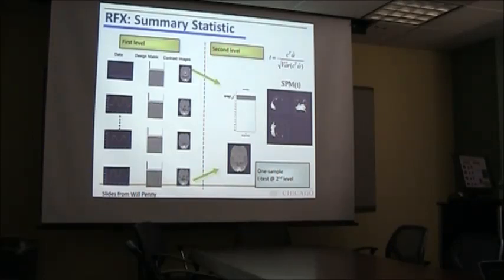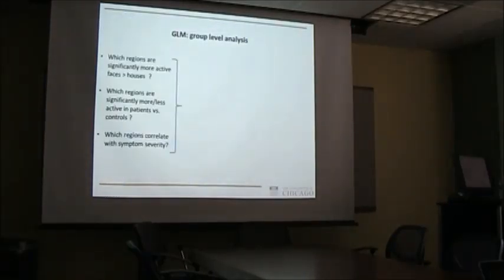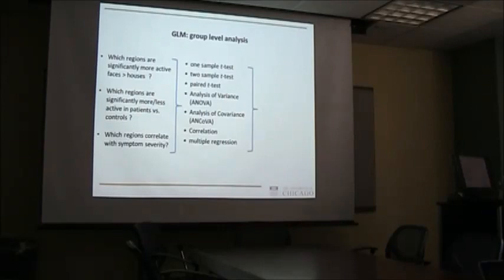And to stick with the example, another thing you could do, for example, is say, in which brain regions do either faces or houses have stronger activations compared to just your circles, something like that. That would be another contrast you could set up, etc. Depending on your research question, you have a bunch of different tests that you can do on this group level GLM analysis.